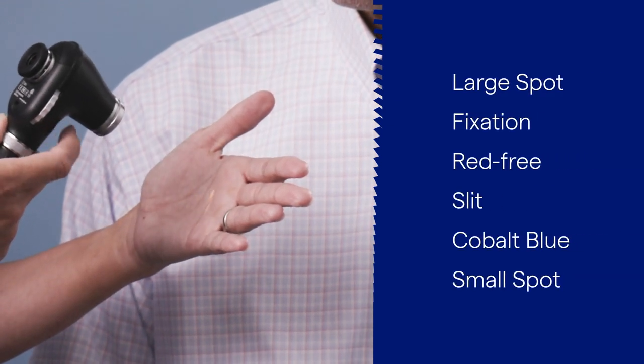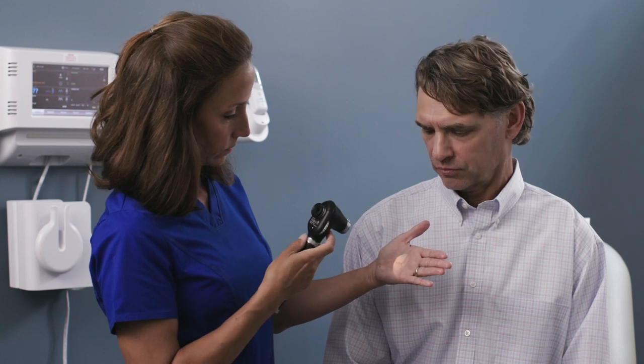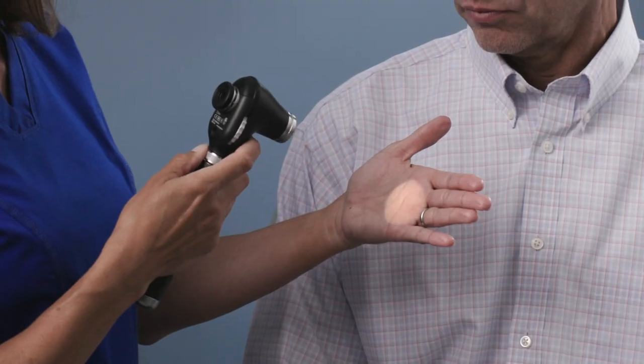The Panoptic features all the familiar filters and apertures. Set the aperture to the appropriate filter. We will perform this exam with the large aperture.